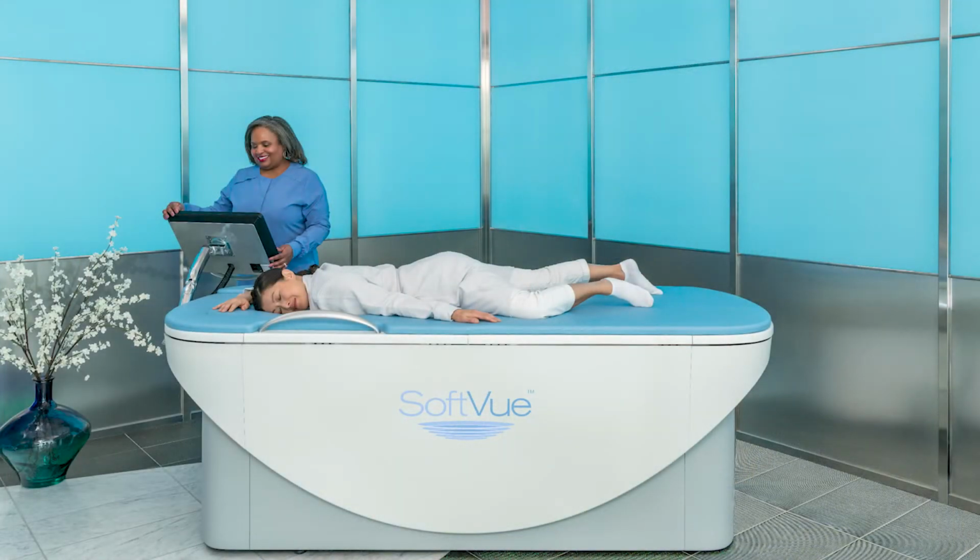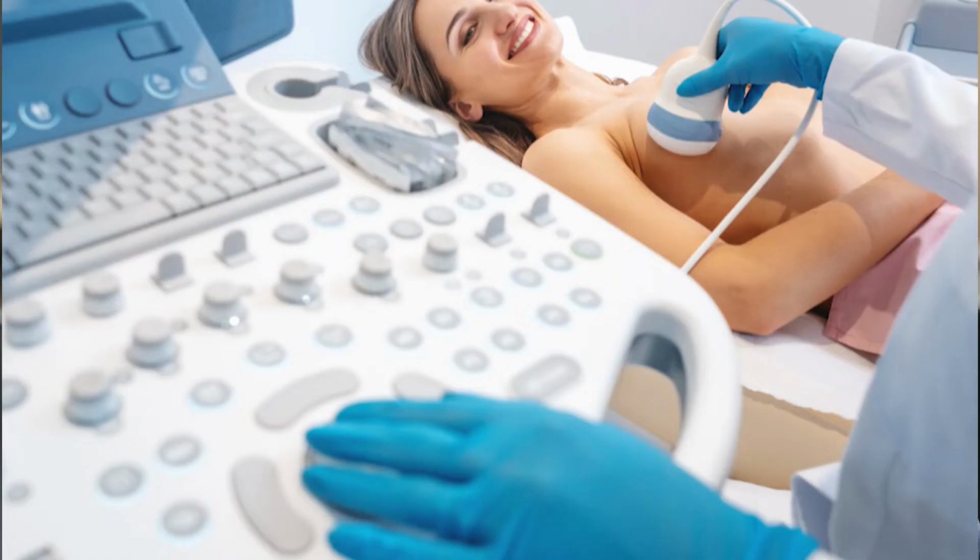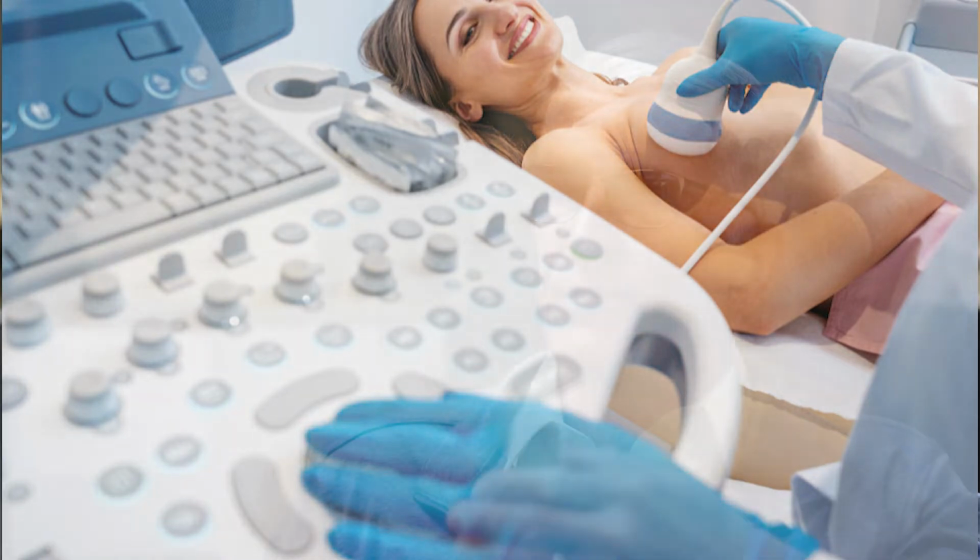Softvue is a whole new form of ultrasound. And what I mean by that is standard ultrasound has for the longest time relied upon sending out a signal, it bounces off the tissues and comes back to the transducer. Thereby it's called reflection ultrasound. And that's been very good as far as characterizing and finding masses in dense tissues. So that's why ultrasound has been used for a long time.